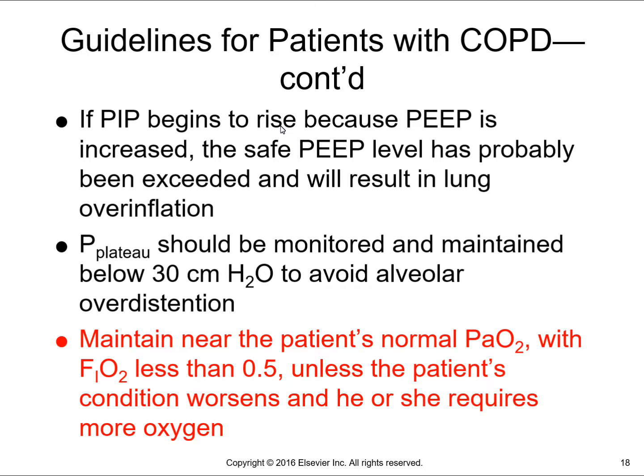So there are times where if I put too much PEEP, I'm going to start driving up the pressures. I'm going to influence cardiac output in a negative way, and it's going to jack up the patient. So we have to just be mindful of PEEP, and we'll talk about optimal PEEP studies on Monday.